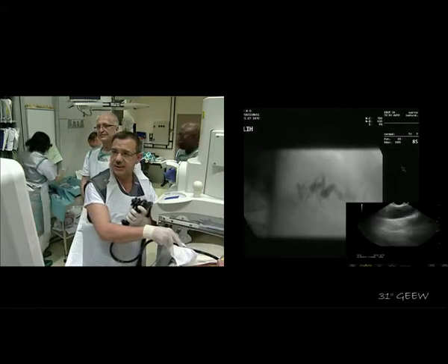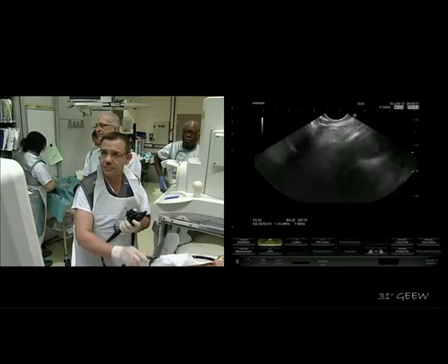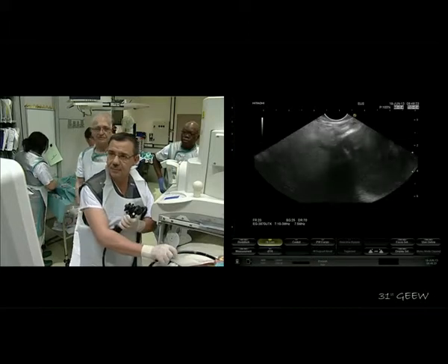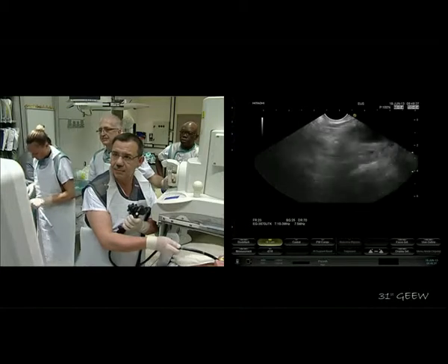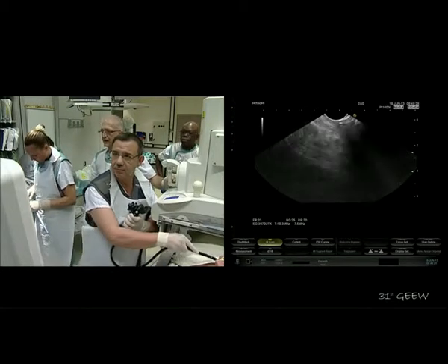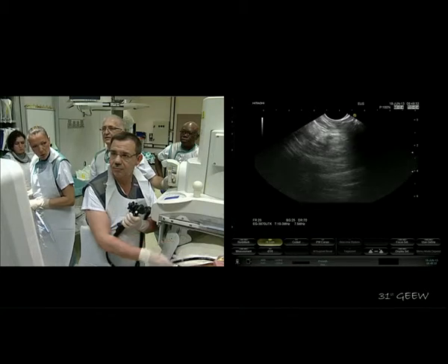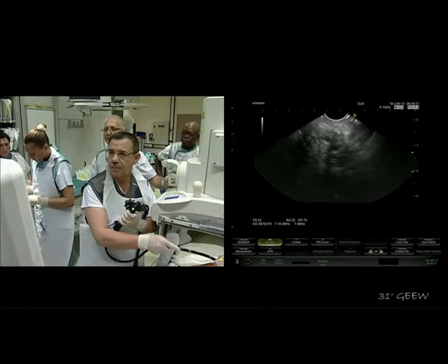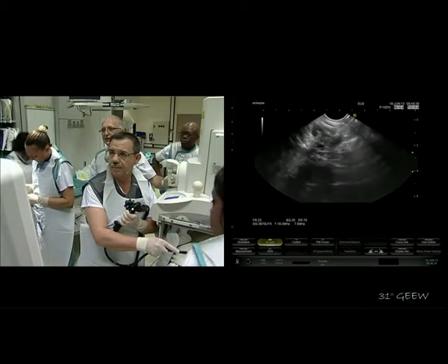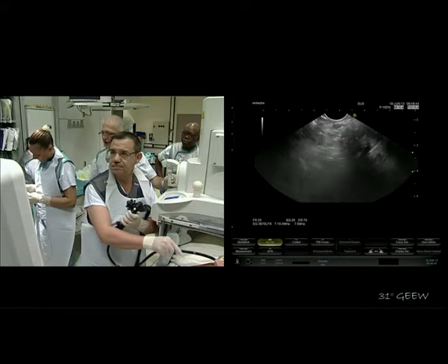This is the aorta. So I think the important message is that it's not only, of course, important to enter the duct, but also the axis that you choose should be the most direct, in order to avoid this kinking. And not only the access, but also the device that you use to enter the duct.